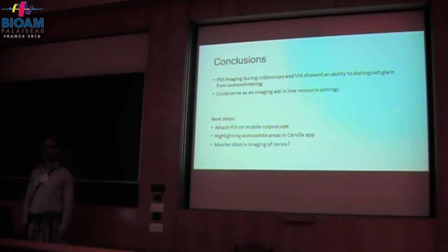Yes, this is right now happening at Scripps Clinic in San Diego in the US. The goal is to acquire 150 patients, and we are around 130-ish. In the US, you don't have as high patient volume as you do in other parts of the world, so the trial is progressing much slower than we'd hoped, but this is something that we are doing. Another thing we're trying to do is develop tools like automated machine learning that will be able to support the person in the field to say, this is something that they should treat and this is something that they shouldn't treat. Because right now they need a lot more support than they have.